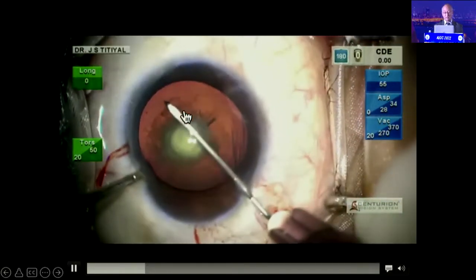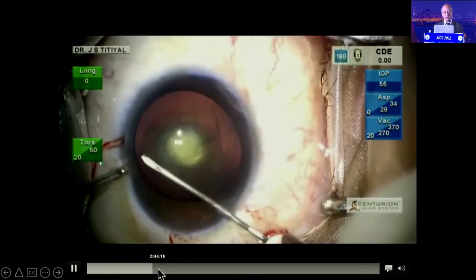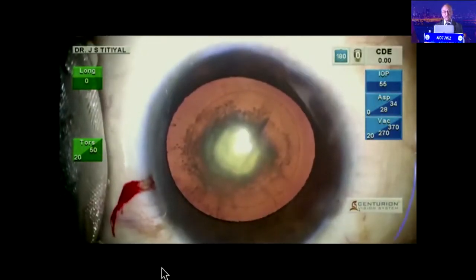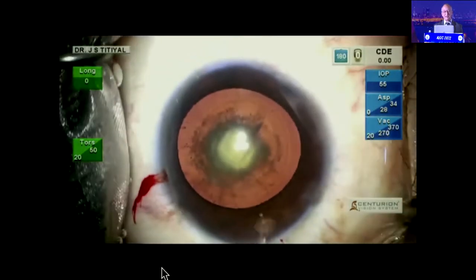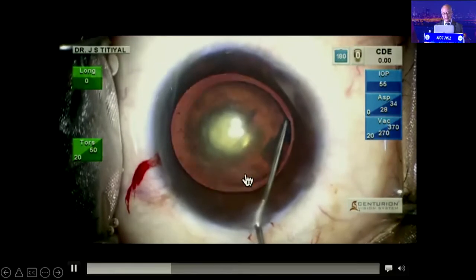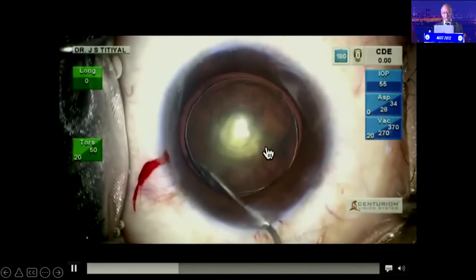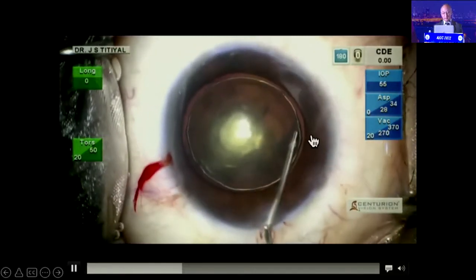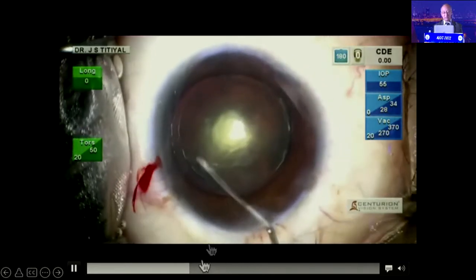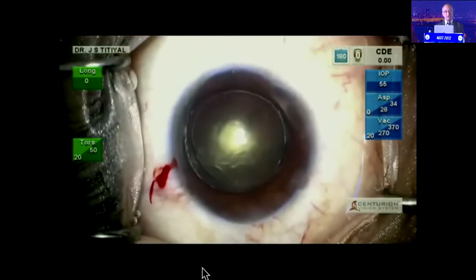So always do a rhexis which is complete and make sure you avoid hydrodissection in most cases and do only delineation, which will help you take out the endonucleus first and then the epinucleus subsequently as per the requirement. If you see here, I'm doing a hydrodelineation. Just doing a delineation, one core, then we'll have a second core happening, which will strengthen the initial hydrodelineation. And subsequently, you can do a layer by layer or chip and flip technique in these softer nuclei.